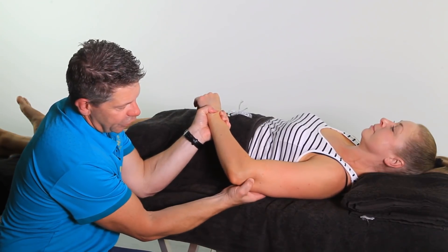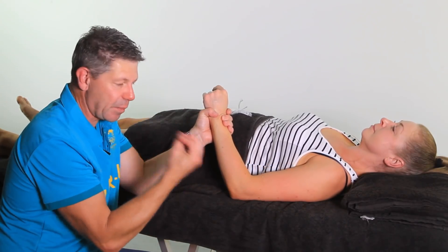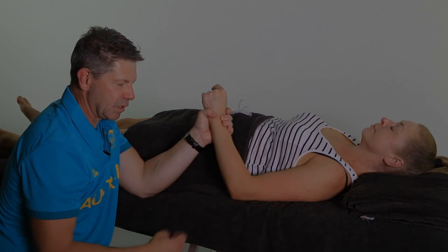As I mentioned before, we've also got the triceps through here — they will also refer into the elbow, so that is another part of our treatment sequence as well.